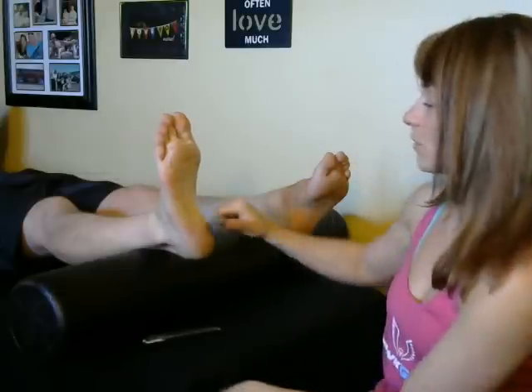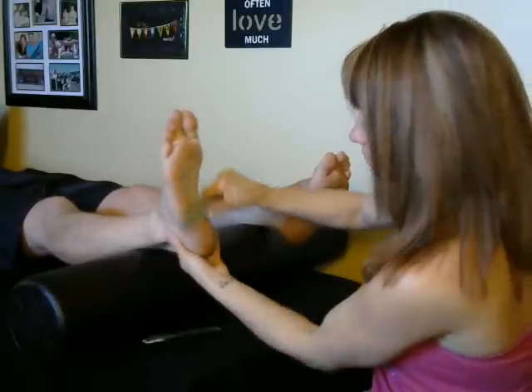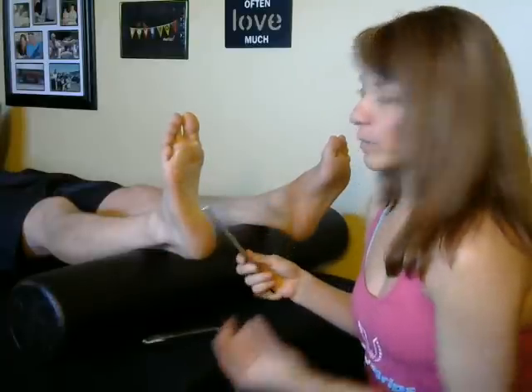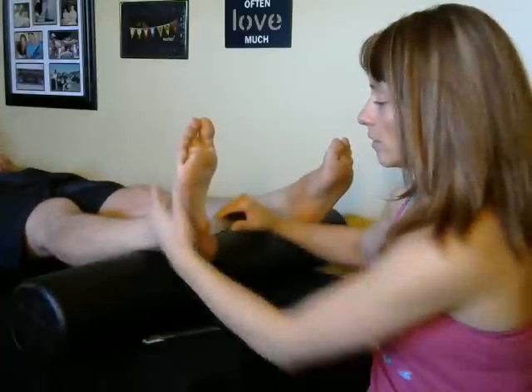Steve, as the patient, describes feeling it hitting against the bottom of his foot with a little shaking sensation — he can feel the reverberations too. When we talk about scar tissue, it can be in relation to fascia. Think of hair: if you don't comb it, it gets snarly. Part of the reason I'm doing this is to comb out those snarls so that the fibers run smoothly, causing optimal function of the kinetic chain starting all the way down at the bottom of the foot.